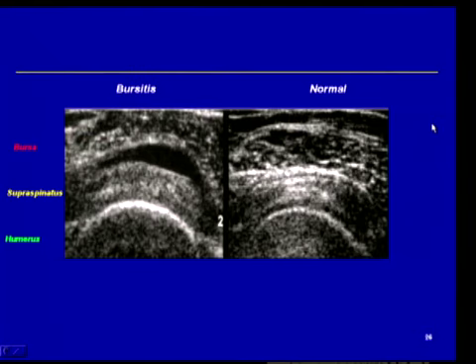Remember that the bursa, which coat the areas so there won't be any irritation of tendons and ligaments, in physiological view, normally have no fluid in there. So in normal individuals, as shown here on the right, you will not see any fluid. It's only when patients are symptomatic where you actually will indeed see fluid. This is an example of a patient that had a supraspinatus bursitis. And actually one of the ways you can tell that it is a bursa, an inflammation, is that you can compress that area and displace the fluid.